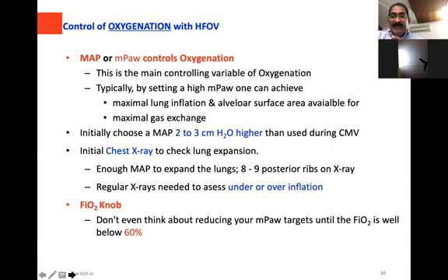But there are many, many things here. Again, as I said, you look at the baby. How is the oscillation? You should train your finger to see, is the wiggle good on both the sides? So it is not only the vision. You look at the baby at the level of the baby. Is the wiggle good? That is your inspection.